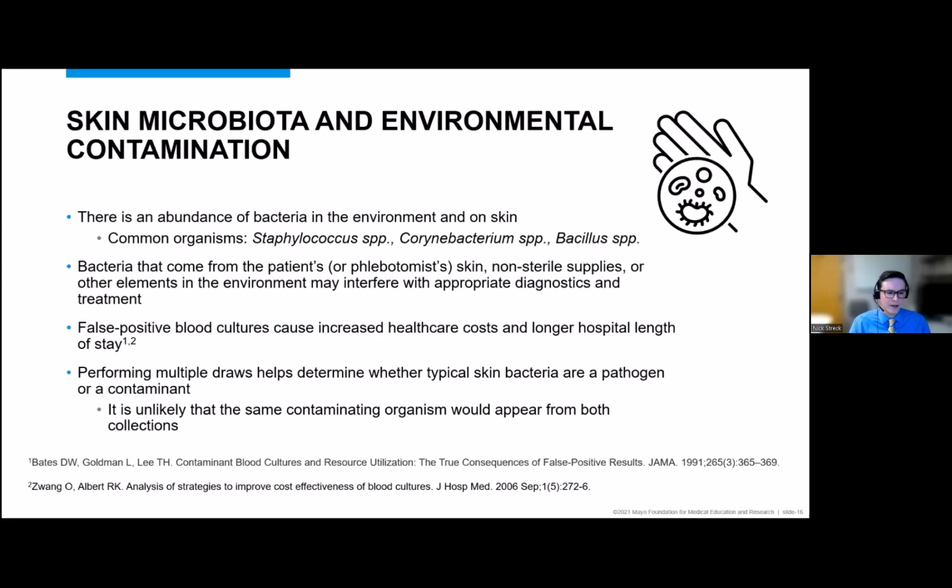And that's where, as I highlighted in the beginning, what we're really testing for is a bloodstream infection. We're really only able to identify what grows in the blood culture bottle, but we don't have a test to be able to tell us which organism is actually responsible for causing the symptoms that this patient has.